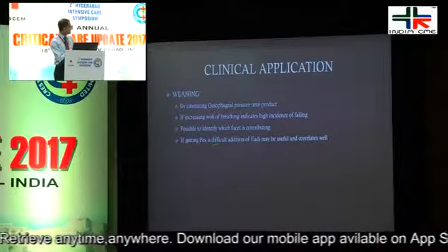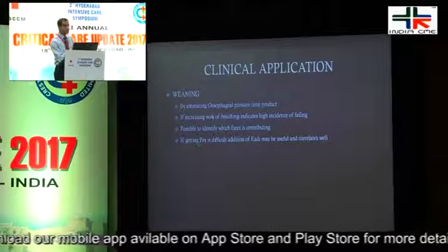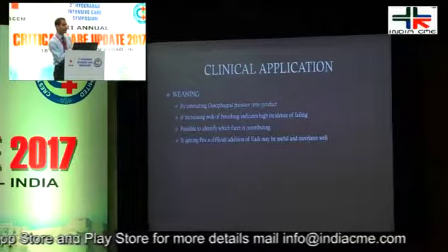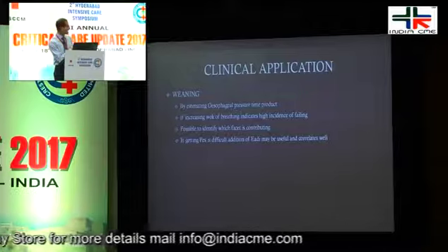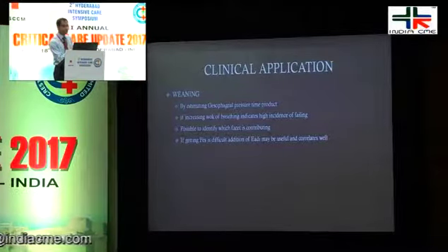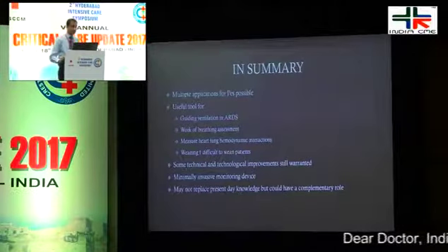Now, if you find that the esophageal pressure monitoring is not very accurate, the diaphragmatic electrical activity can also be added on to the same device, and that will correlate very well with the esophageal pressure monitoring system and can give you additional information to help you in your clinical inputs.